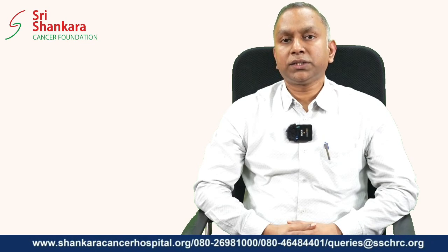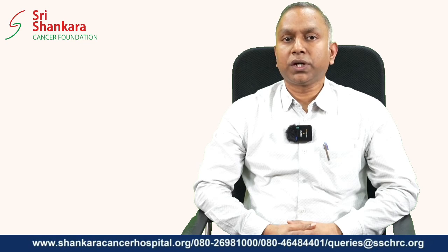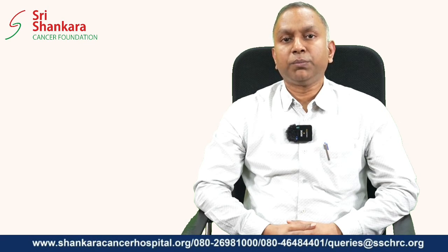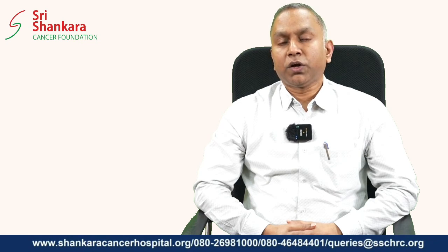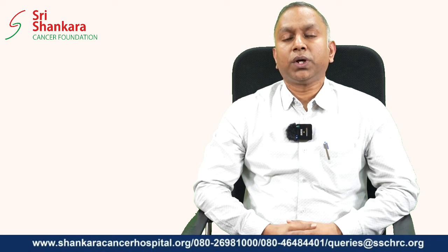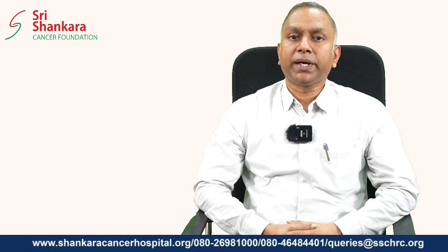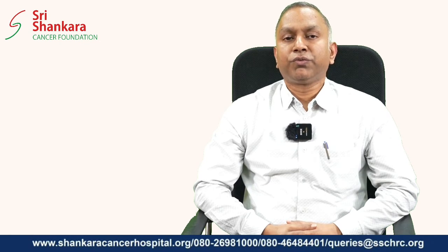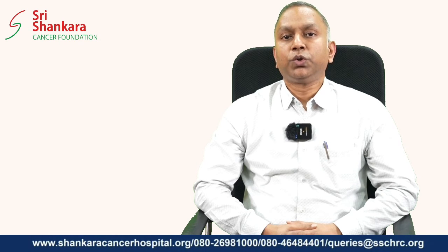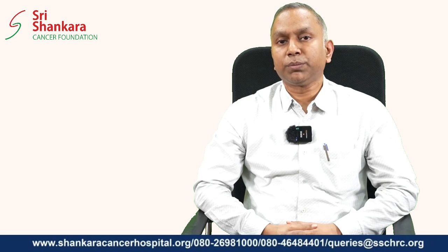The other area where interstitial brachytherapy is of great use is in carcinoma of the prostate. Again, radiotherapy plays a very important role in the prostate. Radiotherapy can be a combination of external radiotherapy and brachytherapy. Similar to other situations, most of the time it is a combination of external beam radiotherapy as well as interstitial radiotherapy. 5 to 6 weeks of radiation will be delivered first, and there will be a gap of 2 to 3 weeks, and then the patient will be taken up for the brachytherapy procedure.